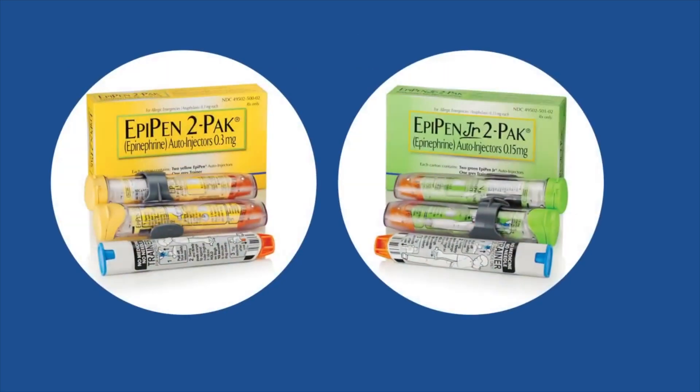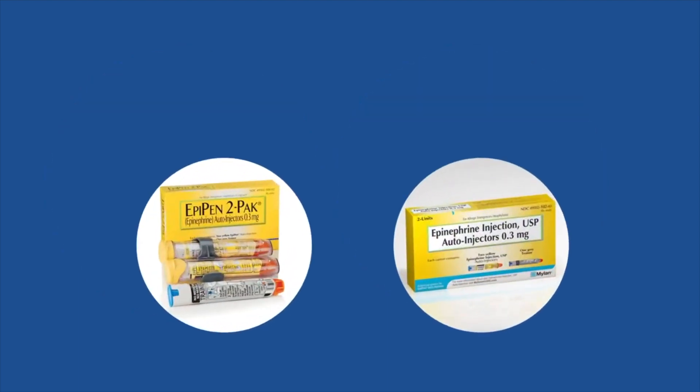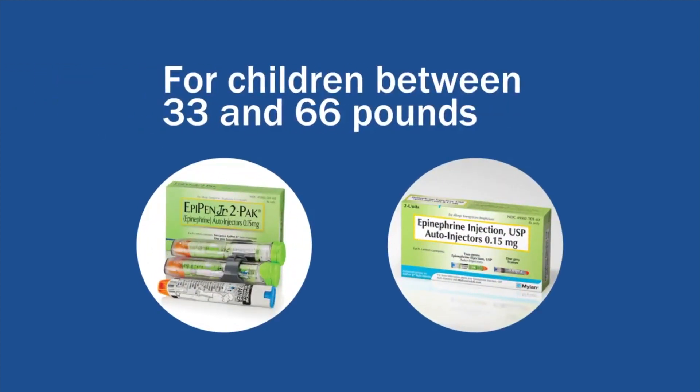EpiPen has four injectors: EpiPen, EpiPen Jr., and authorized generics of each. EpiPen and its generic, with the yellow label, are for anyone who weighs 66 pounds or more. EpiPen Jr. and its generic, with the green label, are for children between 33 and 66 pounds.